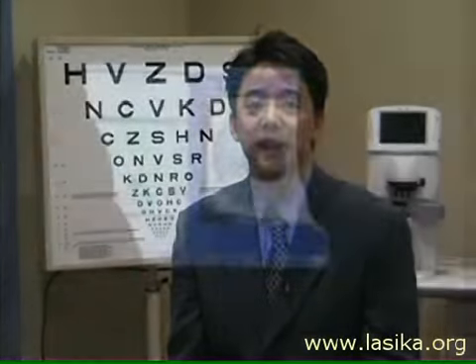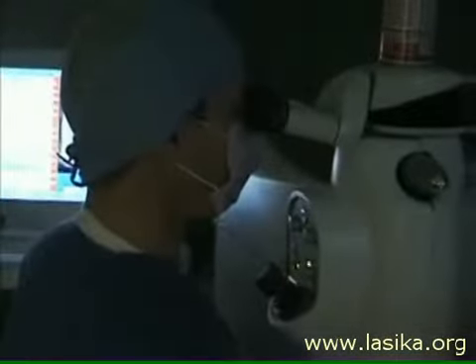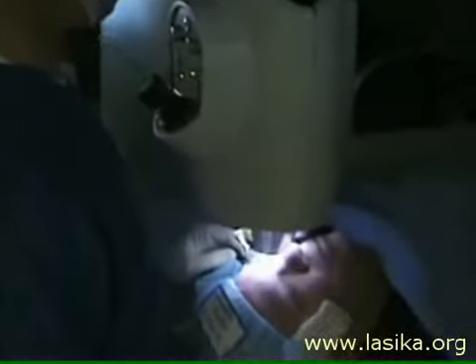LASIK is a way of correcting refractive error. What we're doing here is using the laser to resculpt the cornea, and by doing so we can focus the light directly on the back of the eye. Usually with LASIK we can get rid of astigmatism, nearsightedness, and farsightedness.